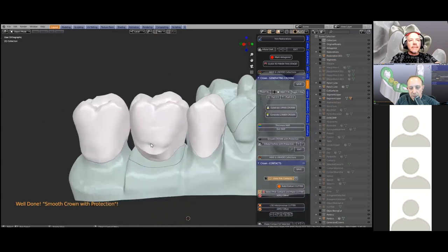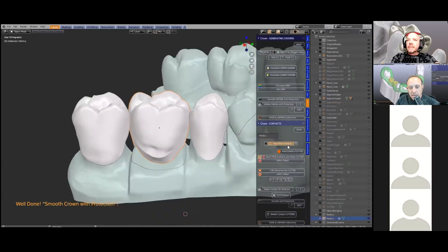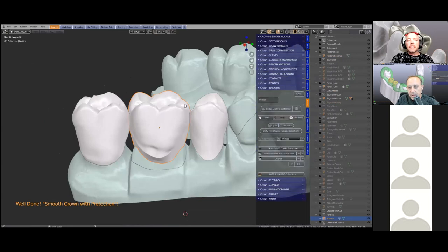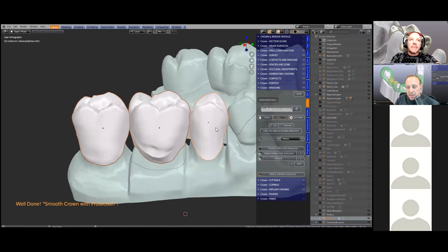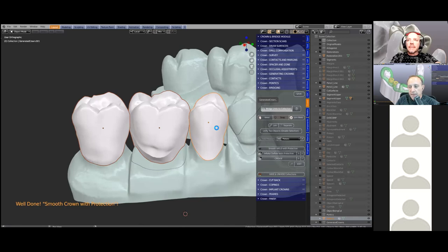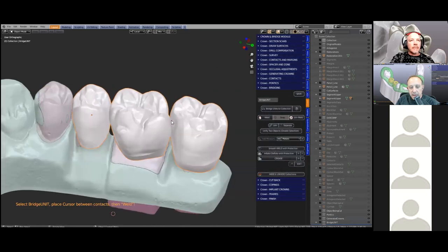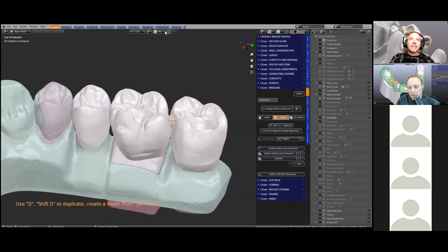Instead of repeating the whole process, Michael's just opening another file which has the molar completed. Next we're going to place bridge connectors between the units to turn these crowns into a bridge — we call this the weld feature. The weld feature will create a kind of a bubble that you can put between the pontic and the actual crown.